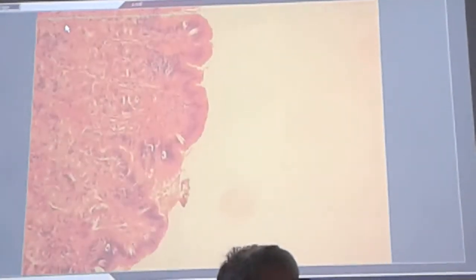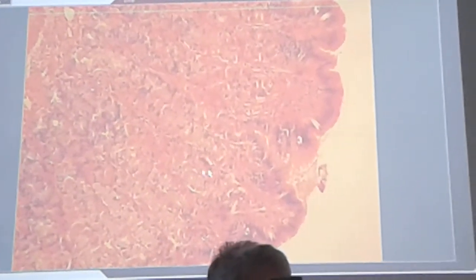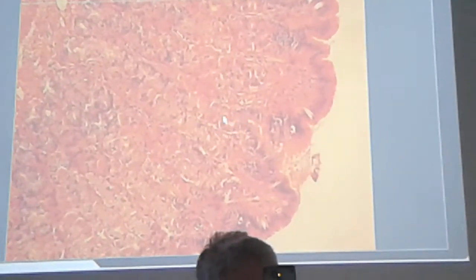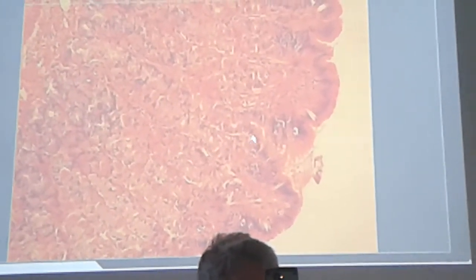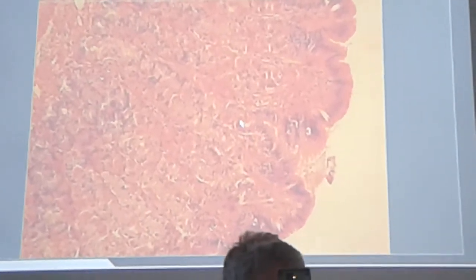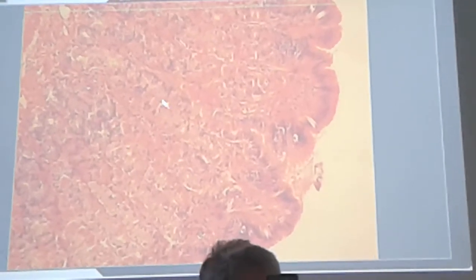Thank you. Now, yes, here we are going through the glands. As I told you, until now it was the surface epithelium, columnar epithelium, and some mucous neck cells, and then we are more in the glandular structure.